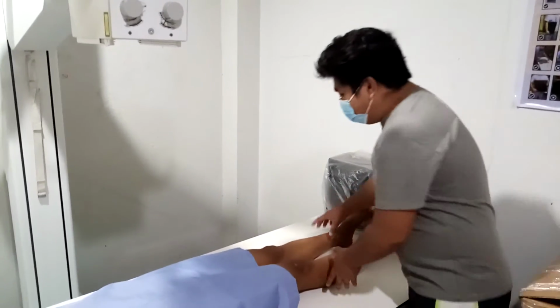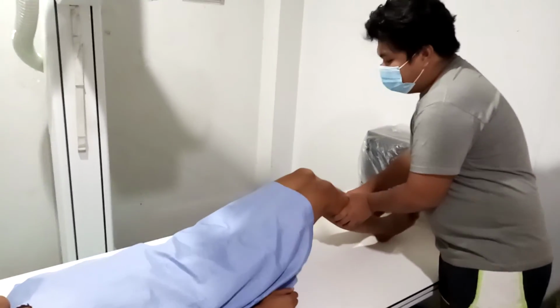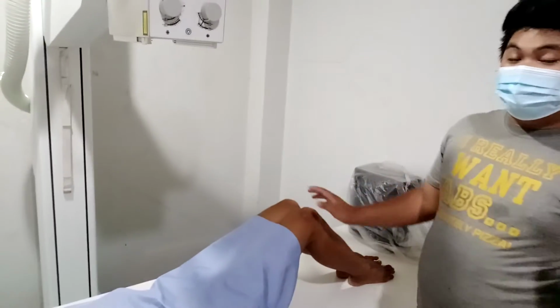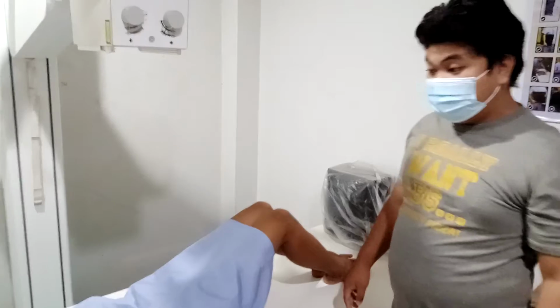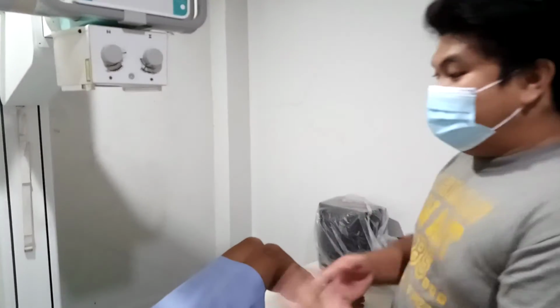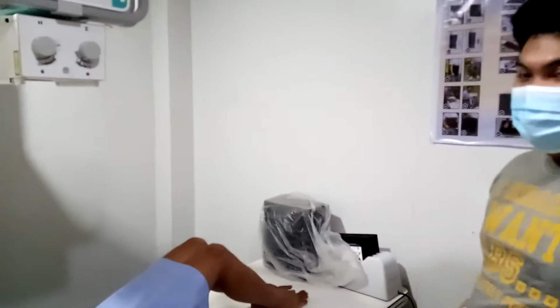So if you're going to flex his hips and knees, you're going to decrease the lordotic curvature of the patient. So the back of the patient will be in a straight line, or straight na siya.